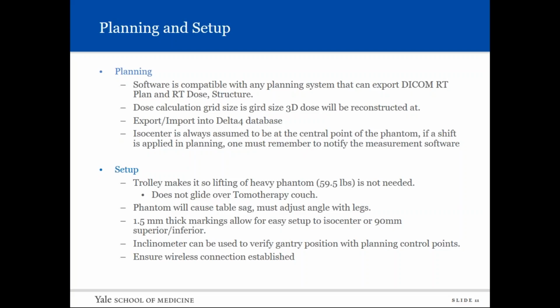Lastly, with the new Phantom, you should double check the wireless connection, I would say. On our first model of it, we did have some initial connectivity issues. We notified ScandiDos, and real quick they sent us some new electronics, and since then it's worked fantastic.